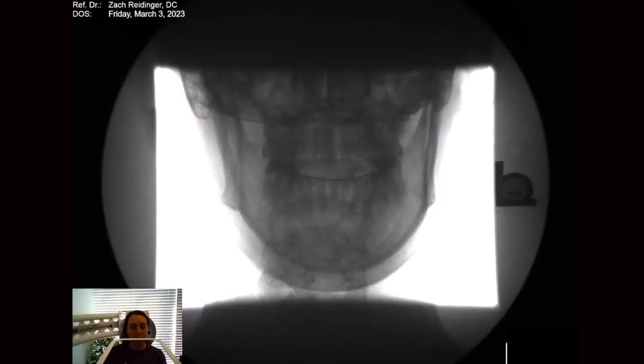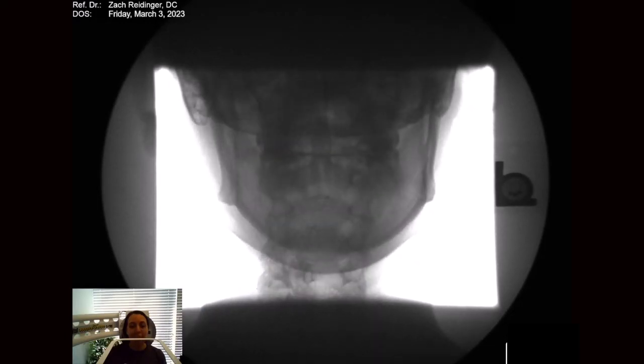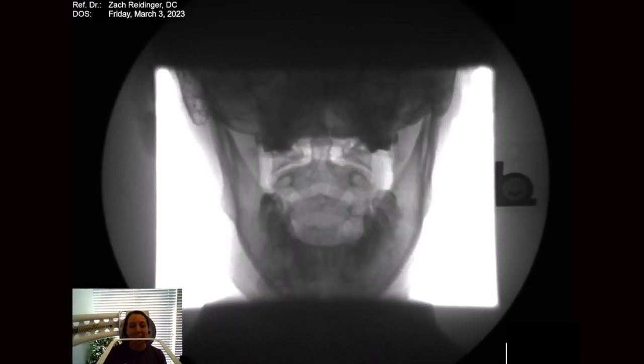Sometimes we can do things in the lower back. It depends on the size of the patient because this is really calibrated for smaller body parts, but a very petite patient, we may be able to find some information for the lower back as well. But let's talk about other joints of the body, extremity joints, meaning pretty much everything else. TMJ, the temporomandibular joint, can be analyzed with digital motion x-ray. We can discover quite a bit with that.